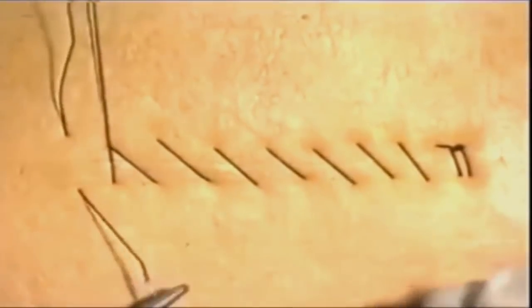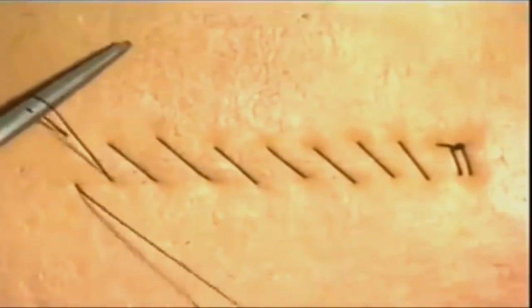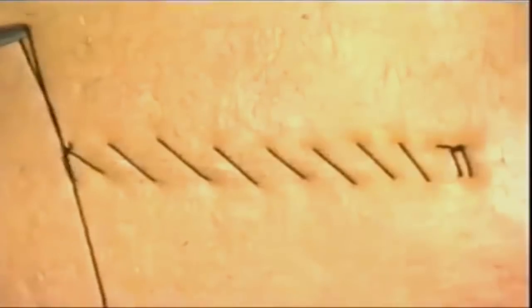After the final suture has been inserted, leave one loop long and then ligate using a standard reef knot technique. Once this has been tied, you are in a position to cut both ends of the suture material.